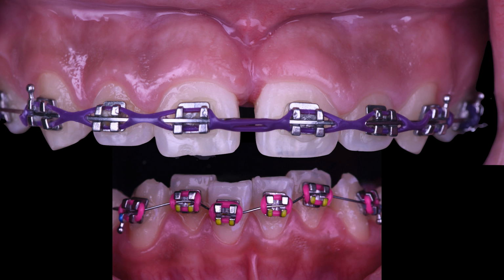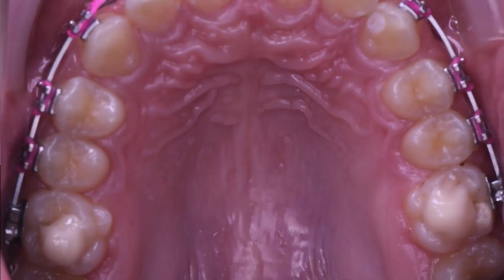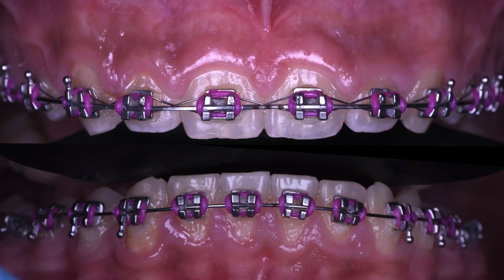I started with a 12 wire in the lower arch to align the teeth. The method of gaining space for the lower arch is by teeth proclination and changing the arch form from V shape to U shape. So here I started with a 12 arch wire, and I expected that the lateral incisors would align beside the two central incisors in the lower arch.